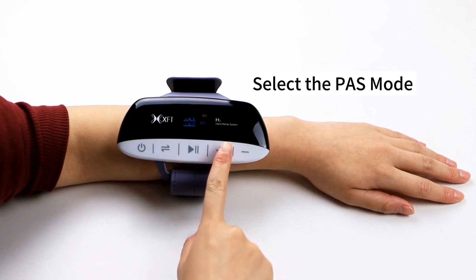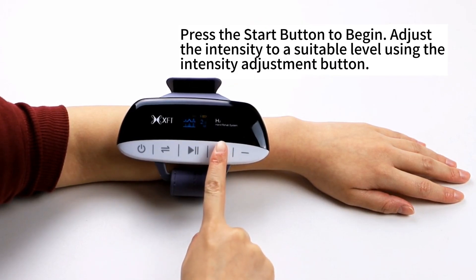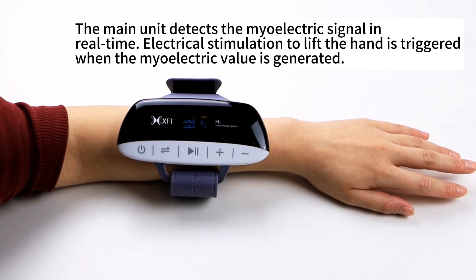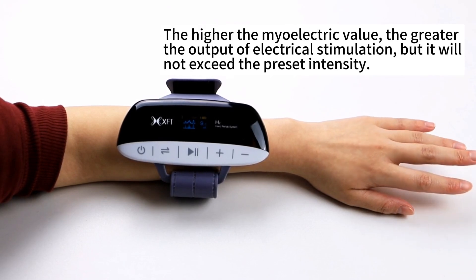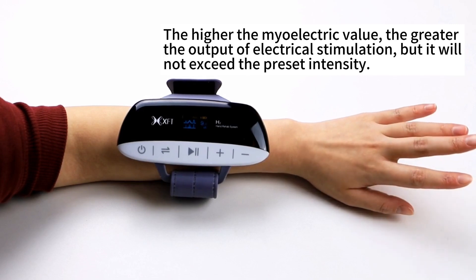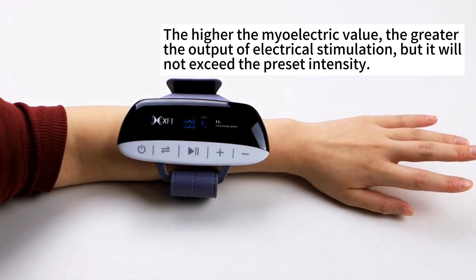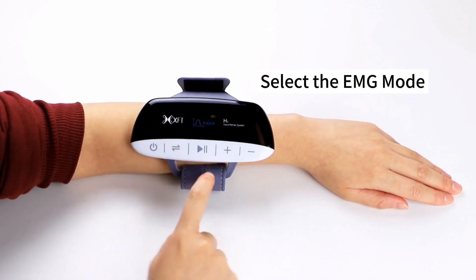Select the PAS mode. Press the start button to begin. Adjust the intensity to a suitable level using the intensity adjustment button. The main unit detects the myoelectric signal in real-time; electrical stimulation to lift the hand is triggered. The higher the myoelectric value, the greater the output of electrical stimulation, but it will not exceed the preset intensity.